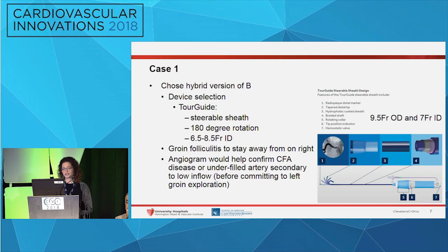It can steer up to 180 degrees, and you can rotate it right and left depending on which side you're working on. And so if it's a 7 French inner diameter that you're looking for, the outer diameter is almost a 10 French, so that's something to consider when you're gaining access.